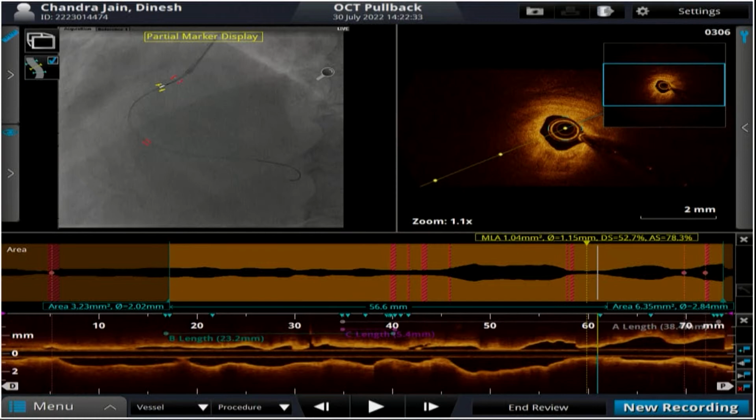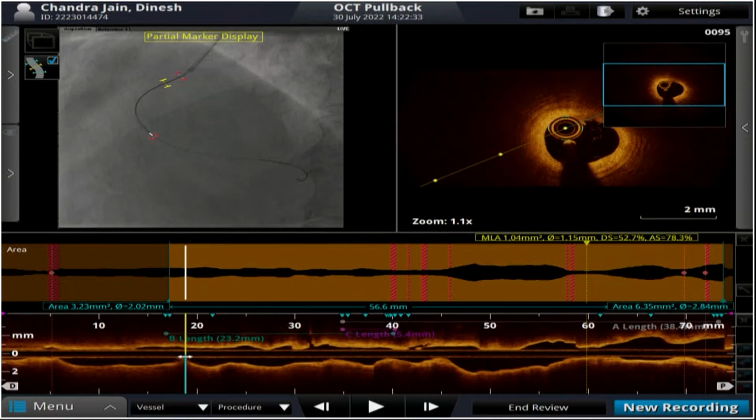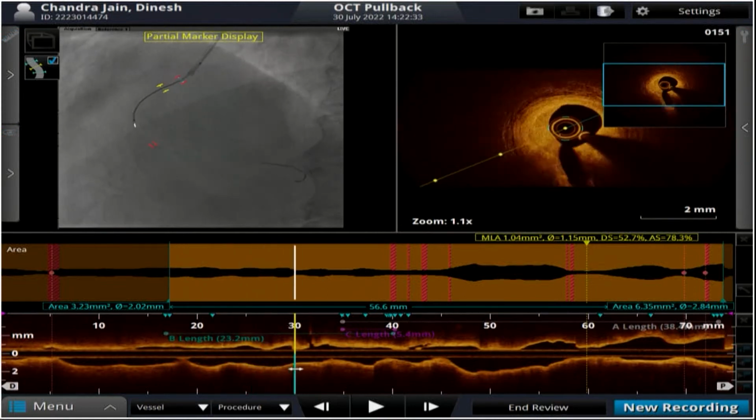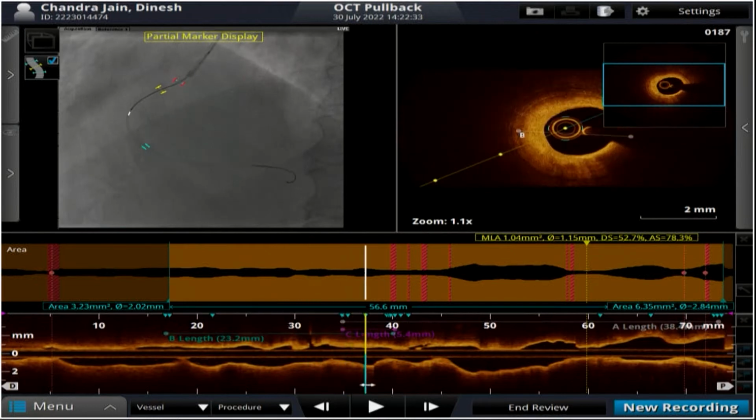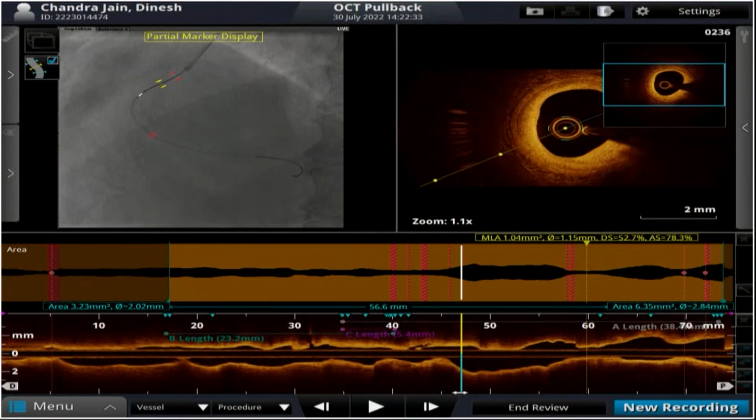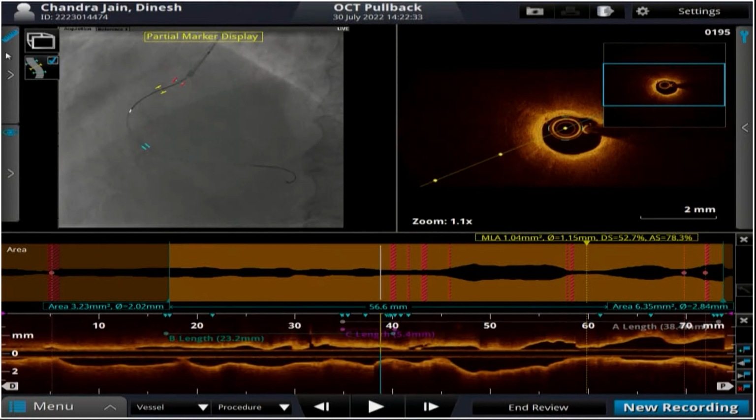No, I just want to remake the point. You are saying that you got co-registration just injecting saline, and the contrast that was there in the catheter was sufficient to give you that co-registration. Is that right? No, sir. It does not require contrast. Co-registration does not require contrast. Cine run, yes, doesn't require. For the 4th time, it does not require contrast.